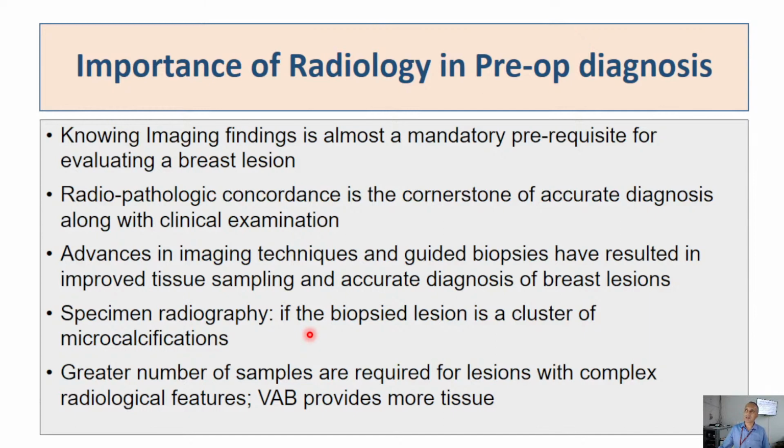And you now have advances in imaging techniques. We've already talked about that, and the guided biopsies, which have resulted in much improved tissue sampling, and our accuracy for diagnosis of breast lesions has really gone up.